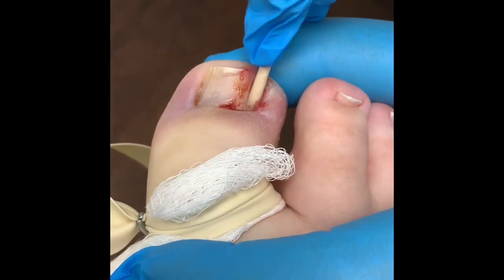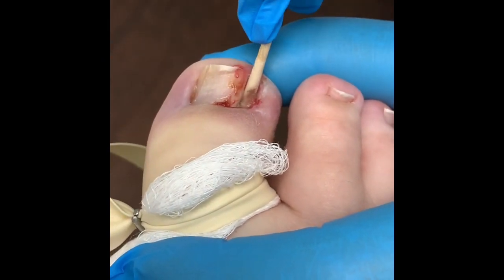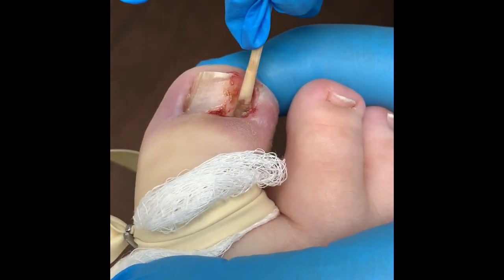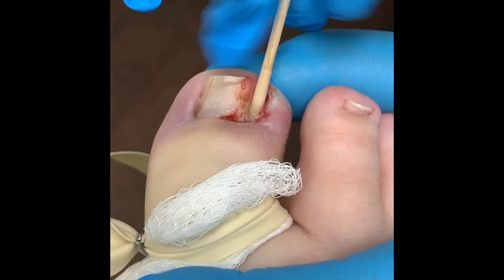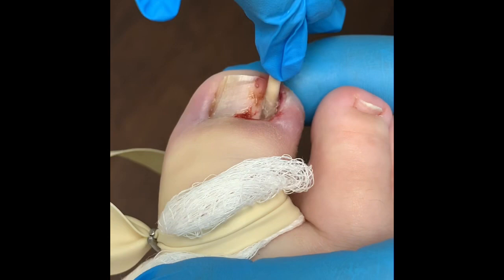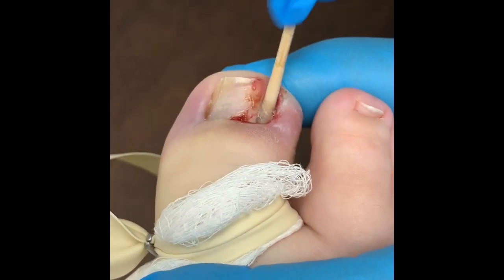Dr. Kushner, what are you doing? I'm massaging the phenol into the matrix — the growth plate. I do it for 45 seconds to a minute.